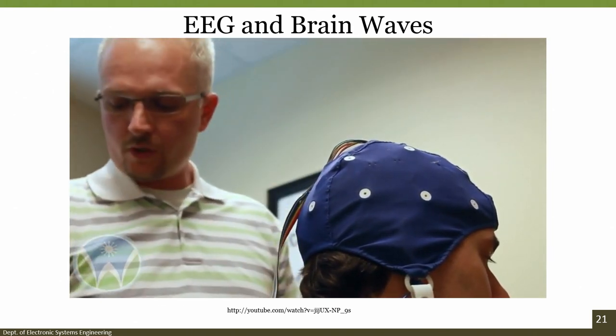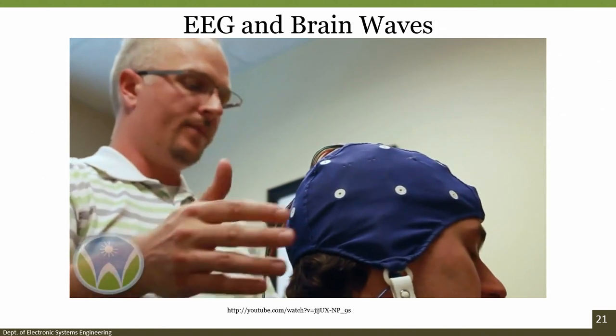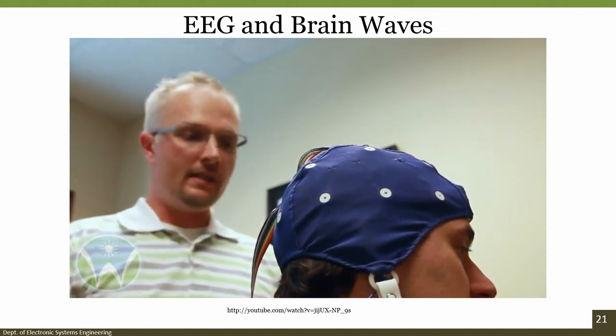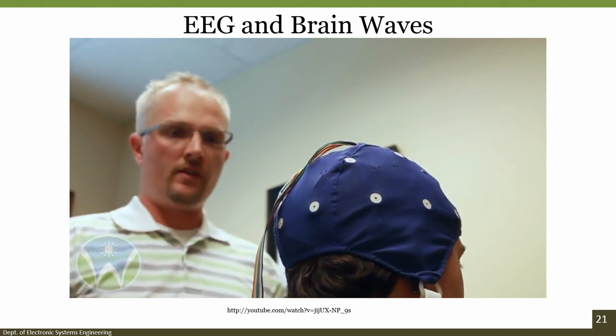And so what you'll do now is just sit here for 10 minutes with your eyes closed. You look forward, sit nice and still, relax your shoulders, your jaw, your forehead, all that. And I'm gonna be behind you here recording the EEG. We'll do that for 10 minutes with your eyes closed, then we do 10 minutes with your eyes open, and then we're done. That's all there is to it.